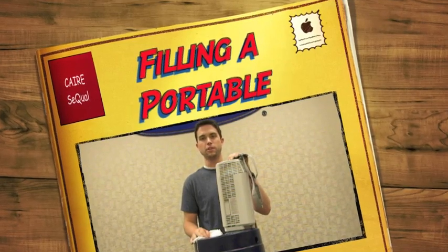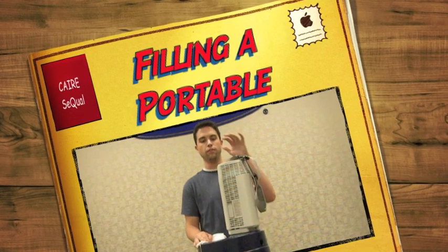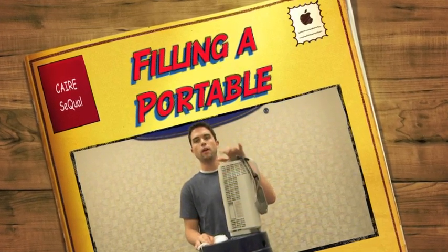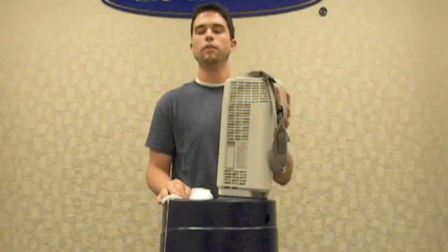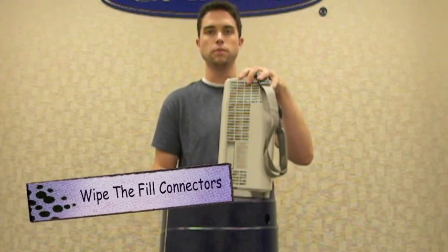Hey there, I'm Taylor Ingram, Field Service Engineer for Chart Industries. Today we're going to go over the proper filling procedure to fill a companion portable unit off of a liberator base unit. This will be the procedure a patient would use to fill their companion portable up prior to use.